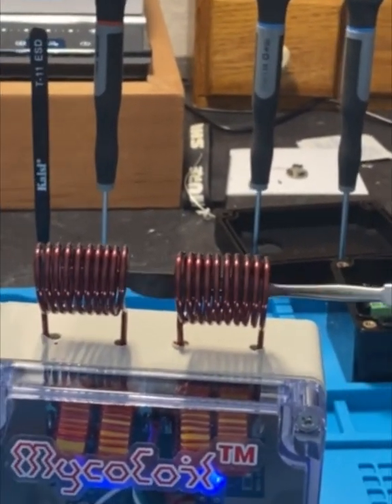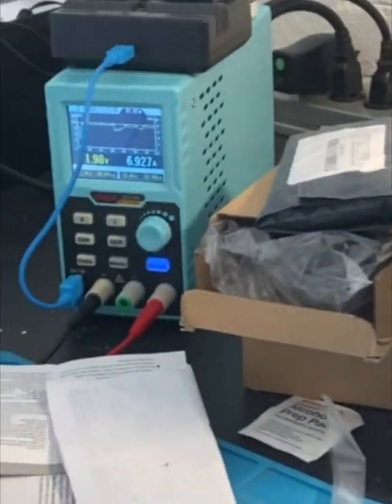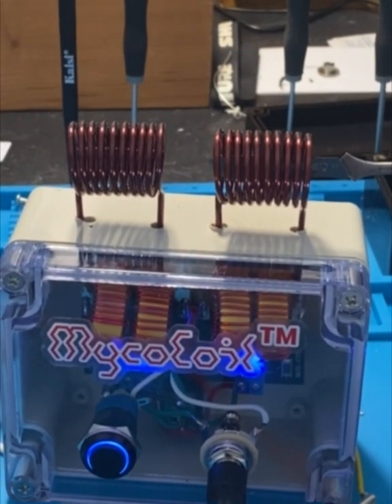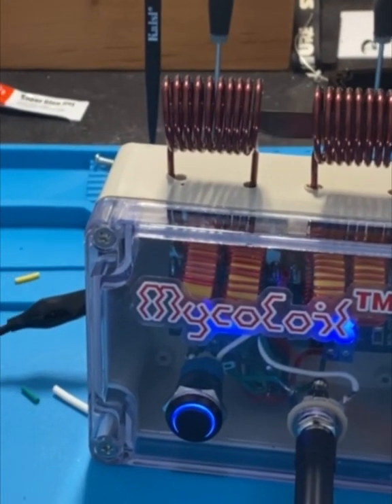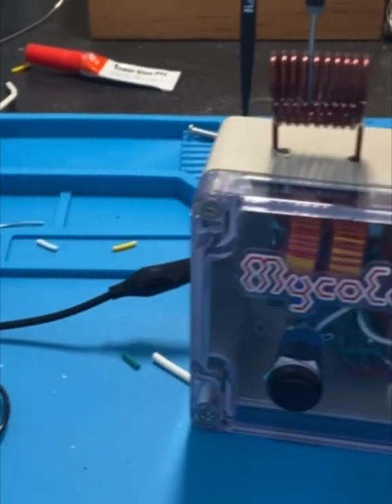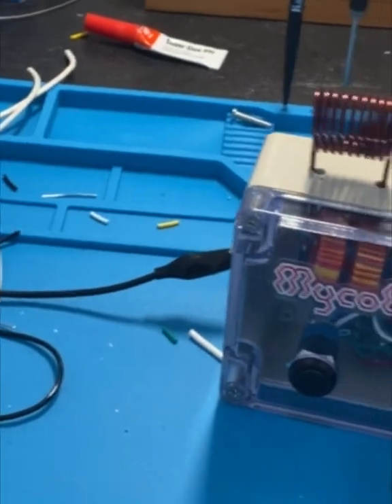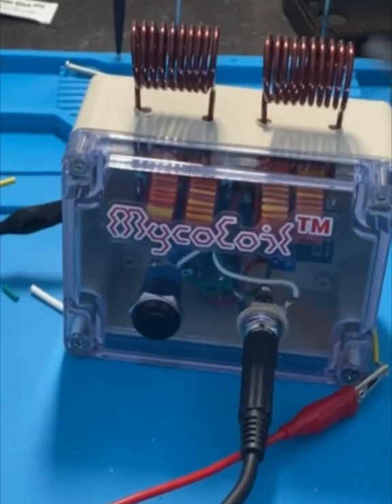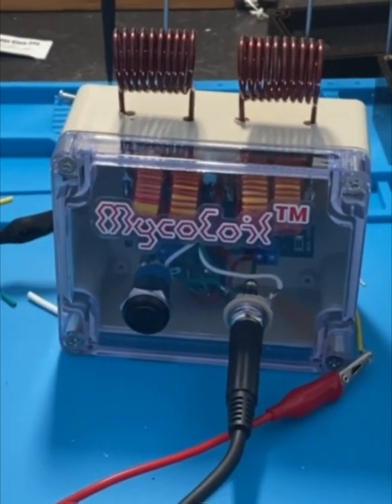Just for comparison, on the regular micro coil, if you insert into one coil it doesn't pull this much amperage. Depending on the size of the metal object and what alloy it's made out of, it'll pull a different amperage, and it'll change as you pull it in.